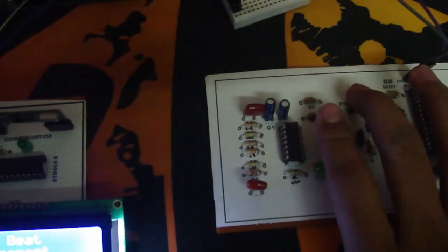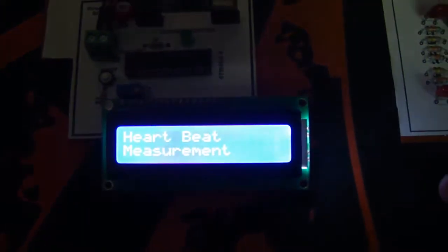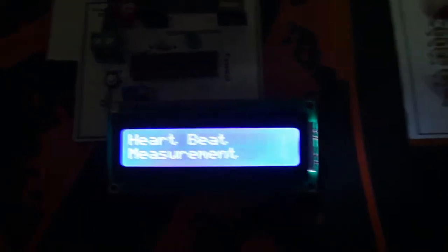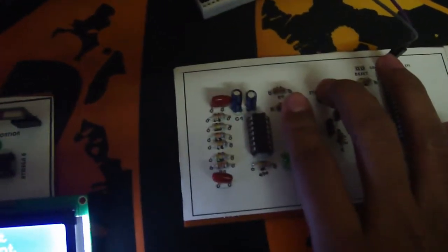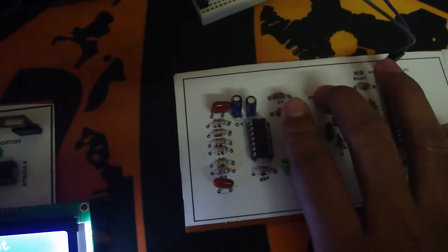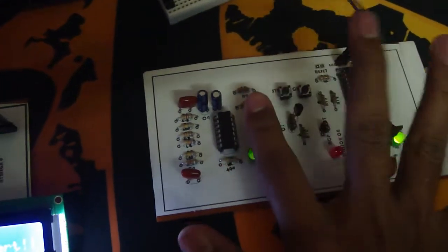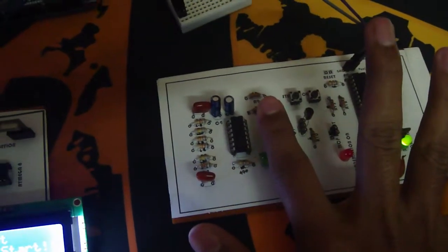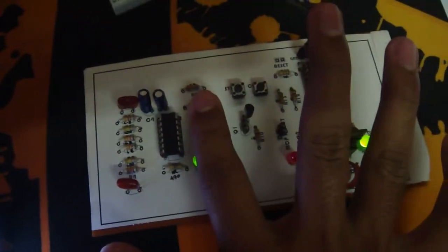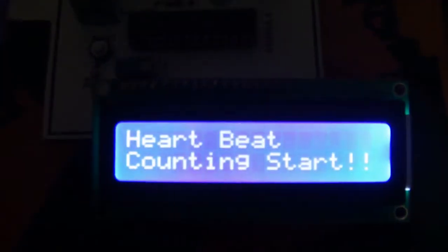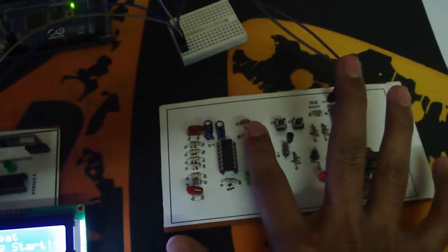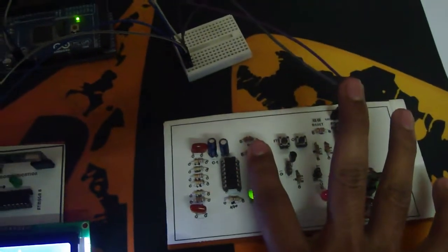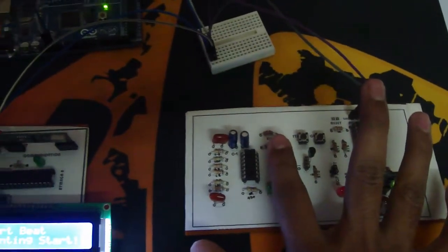When I press start, it will say 'Counting Start.' I'm pressing my finger here and pressing the start button. You can see here that heartbeat counting has started. Now heartbeat counting is going on.